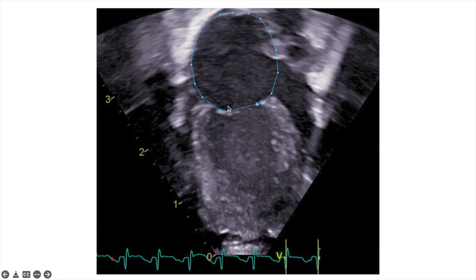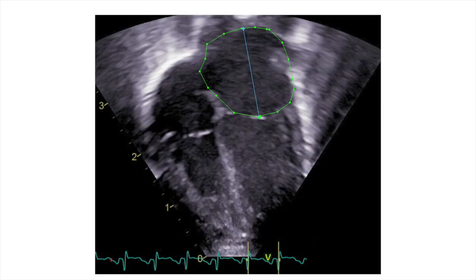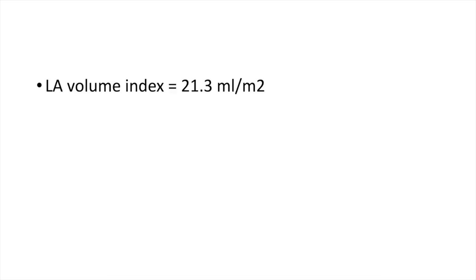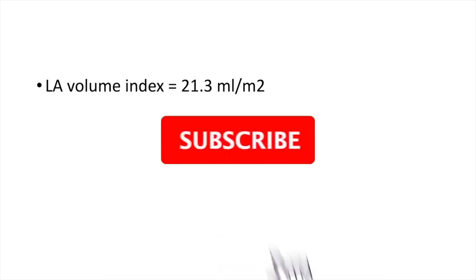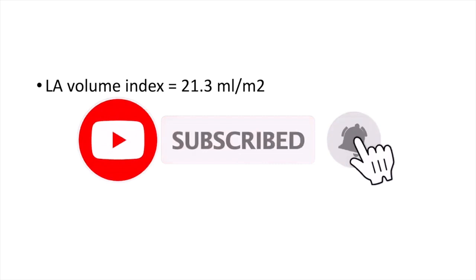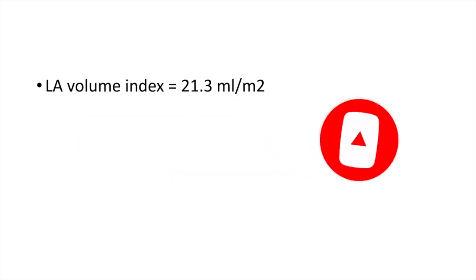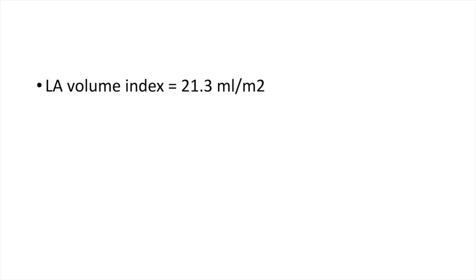For the length of the left atrium, we get it from any of these views. Here I'm getting it from the apical four-chamber view — you can see this is the length. Based on these measurements, the software constructs a 3D shape of the left atrium and estimates its volume. In this example, the left atrium volume index was 21.3, which is a useful number to track during subsequent assessments.